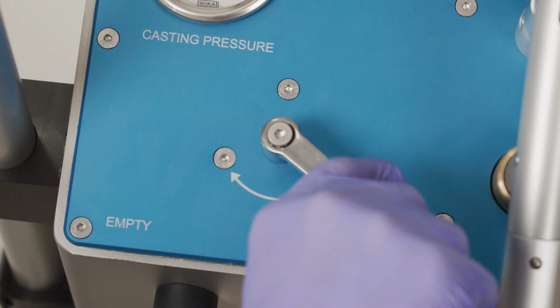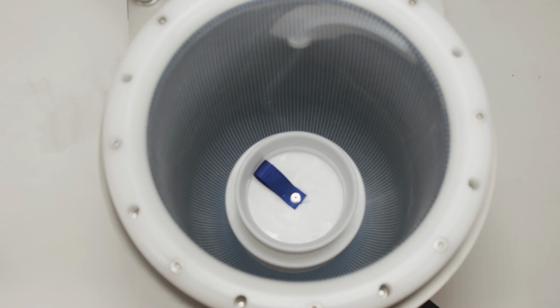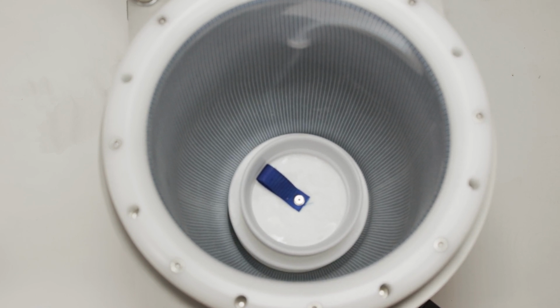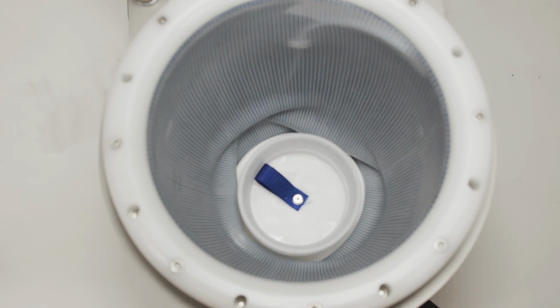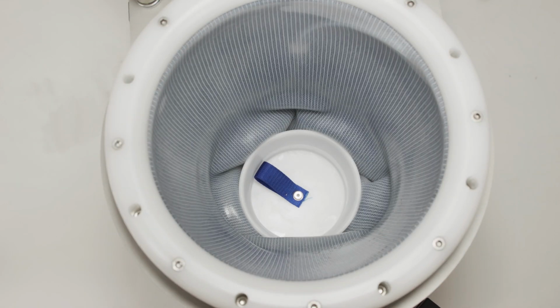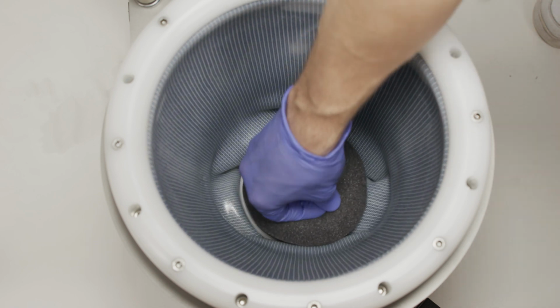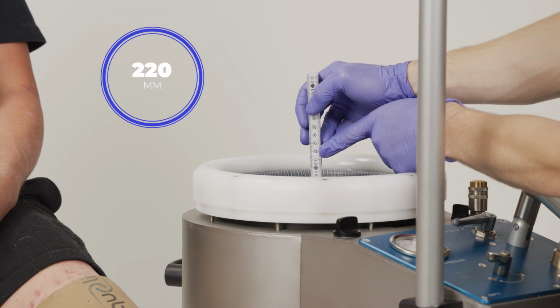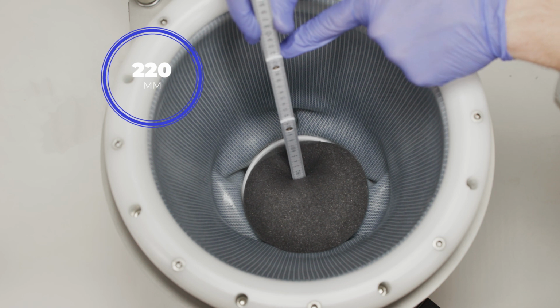Set the gauge to fill, and pump water into the pressure tank until the membrane lies at the level of the foam cushion. This saves time during the plaster impression. Check the desired socket height again with the vector tower, the distal end cap and the foam cushion inserted. In our case, the reading should be 220 mm.